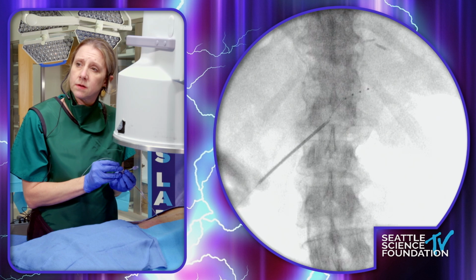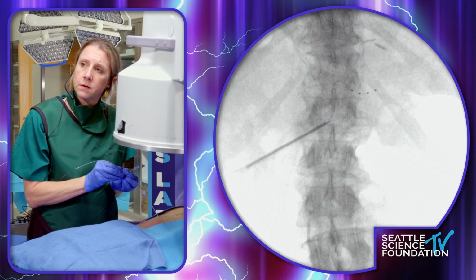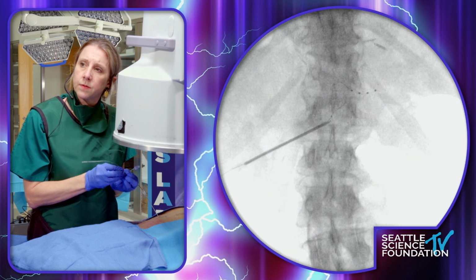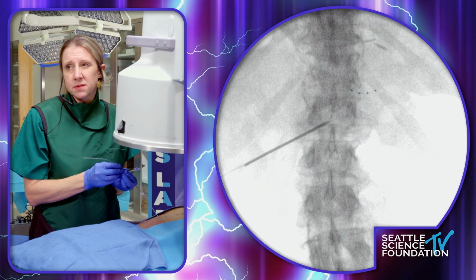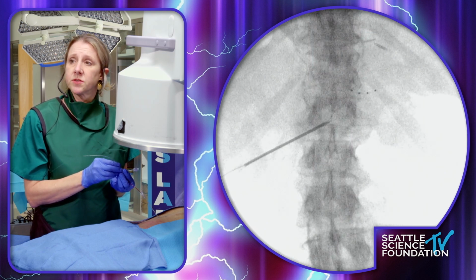Live. Stop, please. Okay, so I do have a small superior loop, which would be sufficient for the purposes of a trial. I'd love to see it a little bit bigger, but truly this is sufficient for the purposes of a trial.